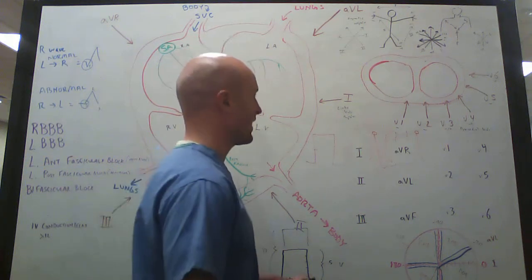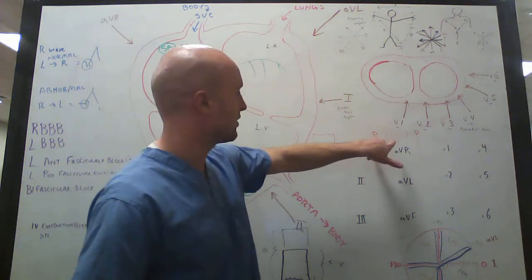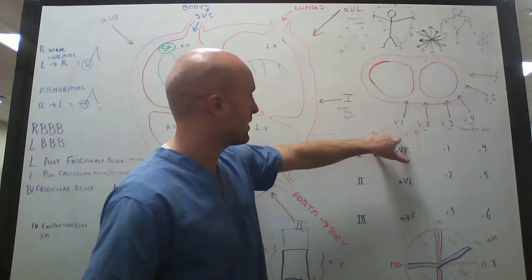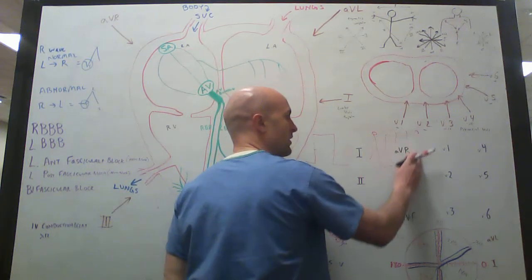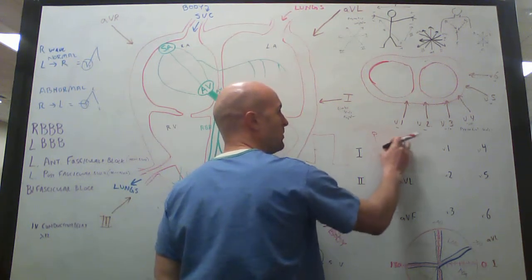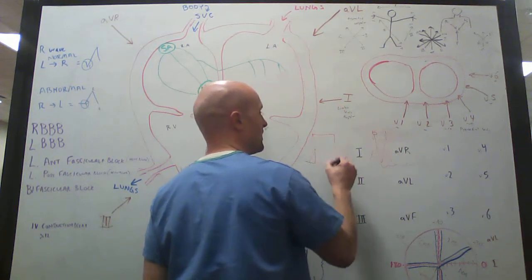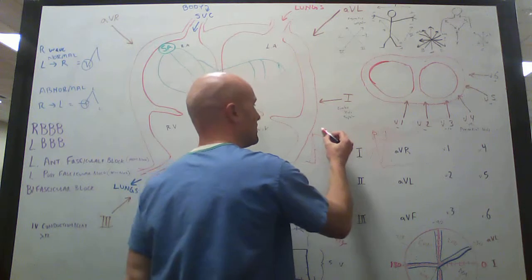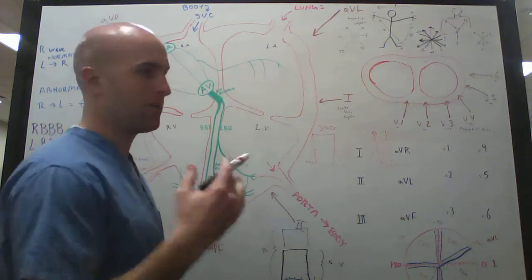Looking at this, I'm not doing this very well, just to familiarize you. If the peaks here are 1 box apart, like here's a peak and then here's the next peak, that means this person's heart is beating 300 beats per minute.